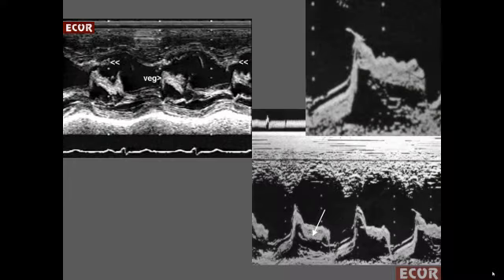Always remember that small vegetations may not be identified on 2D echo, but are perfectly seen on M-mode. The big ones, everyone makes the diagnosis if there is clinical suspicion. But in a patient with high suspicion of endocarditis where the 2D echo doesn't show a vegetation, we have to sweep slowly all the valves with M-mode, and we may find these characteristic and diagnostic signs of a vegetation.